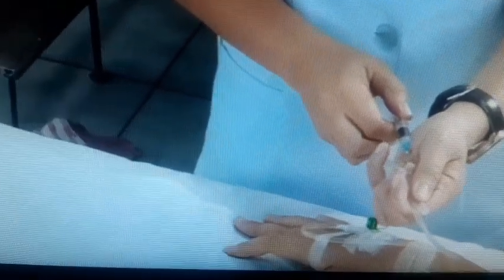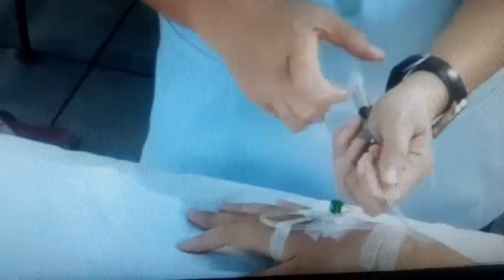When blood arrives, check the blood and client information with a second nurse. Compare the blood package with the order slip, checking the client's name, hospital number, blood type, expiration date, the client's name band, name and hospital number on the name band, and if typing and cross-matching were done. Complete the blood bank slip with the date and time of transfusion initiation and the nurse checking information. And check and record pulse, respiration, BP, and temperature.